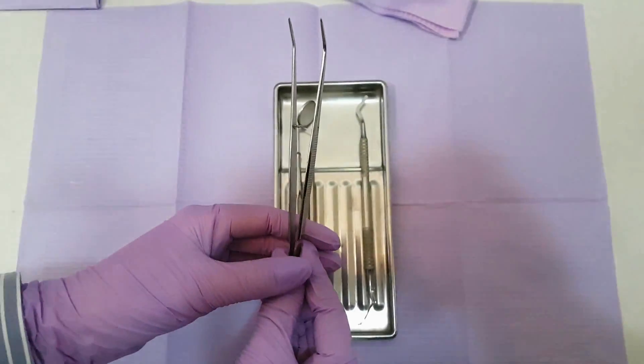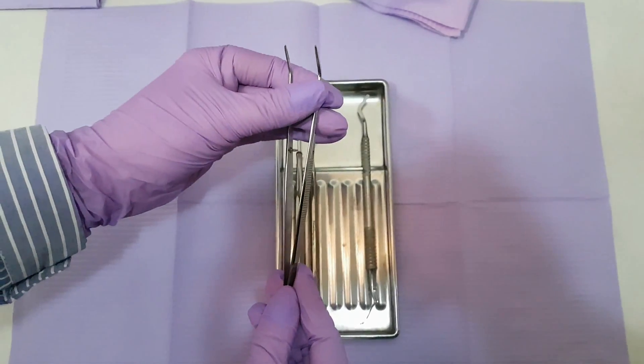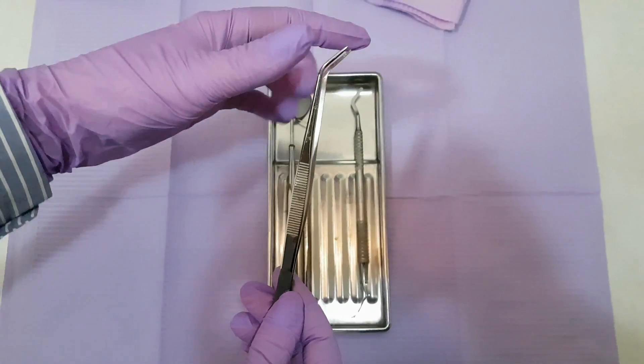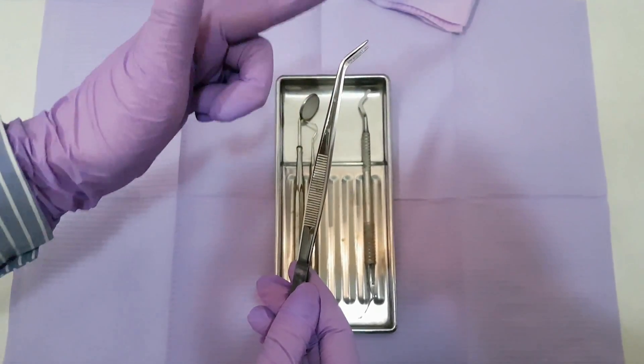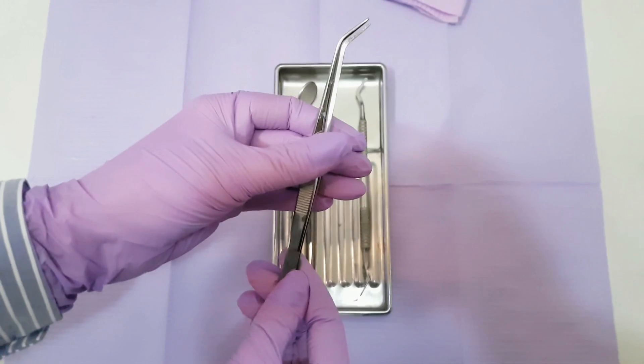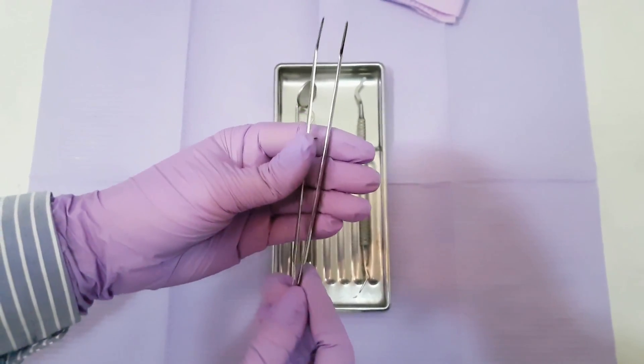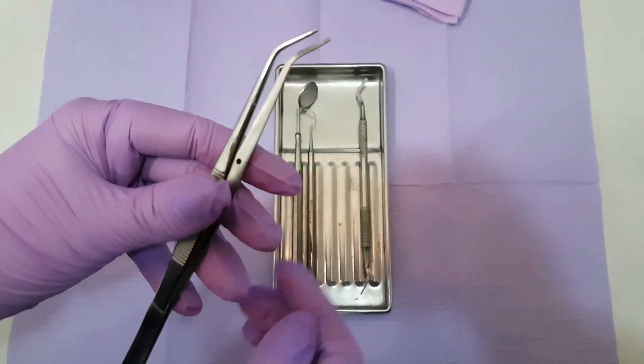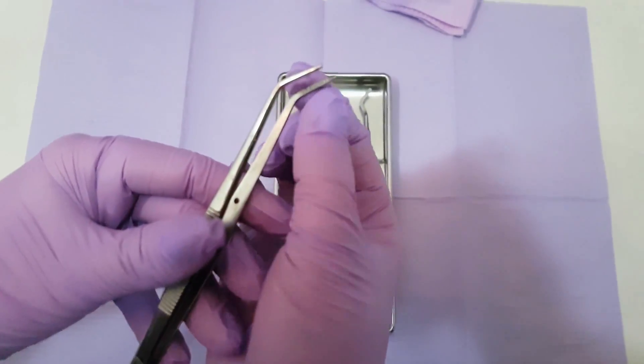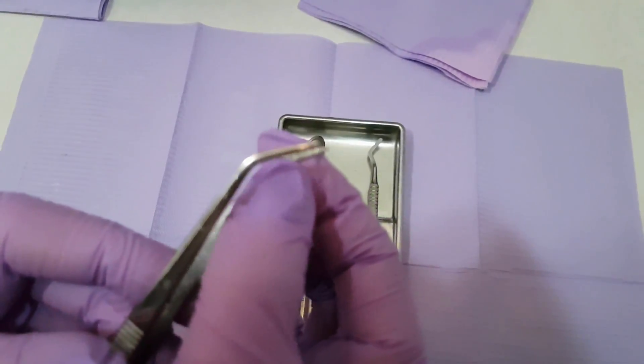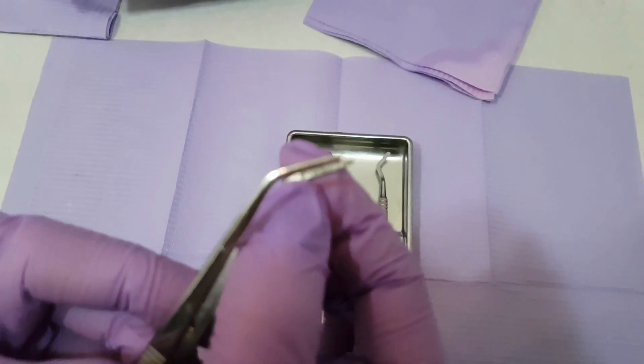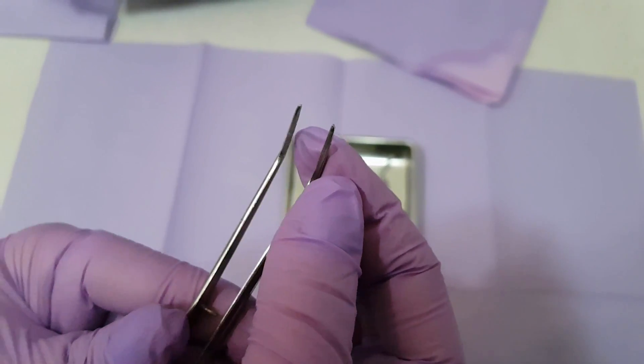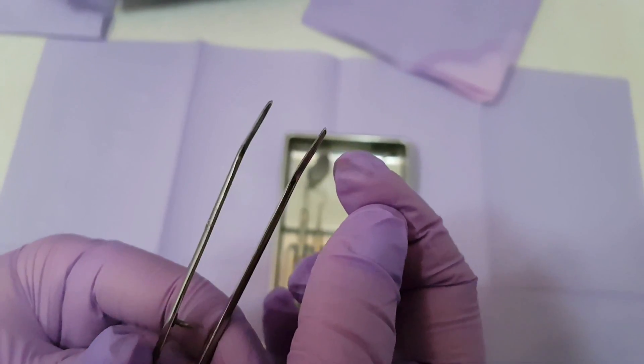And this is a pair of tweezers. There are two kinds of tweezers: regular dentist ones and surgical. This is a regular dentist tweezer. It is used to pick up small items during different dental procedures. This is the working part we pick up things with. And we can open and close it of course.